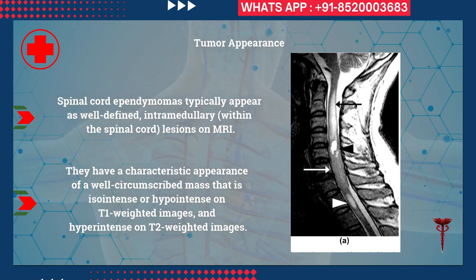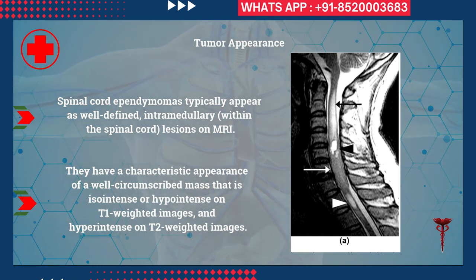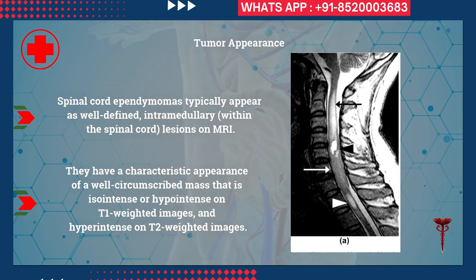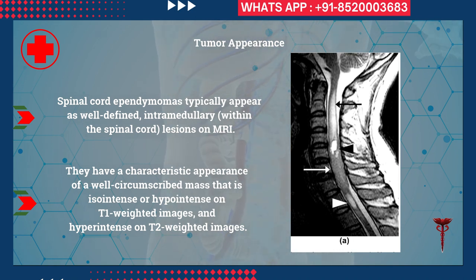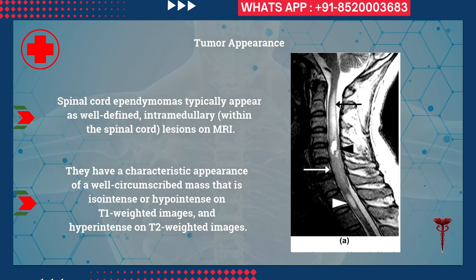Spinal cord ependymomas typically appear as well-defined masses - you can clearly appreciate the margins of the tumor in the sagittal, axial, and coronal cuts. They have a characteristic appearance of a well-circumscribed mass that is isointense to hypointense on T1-weighted images and hyperintense on T2-weighted images.